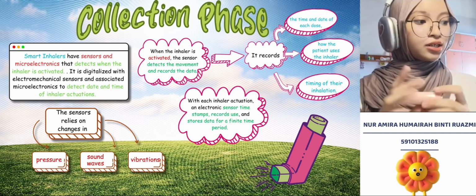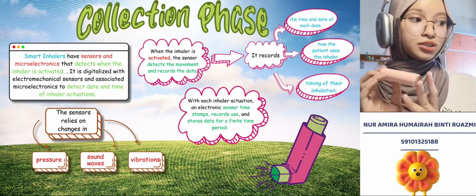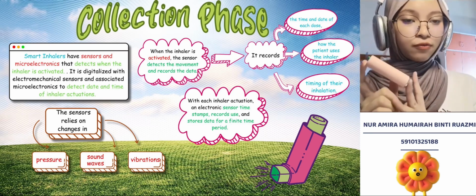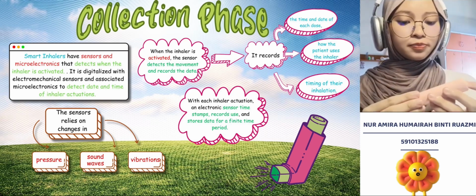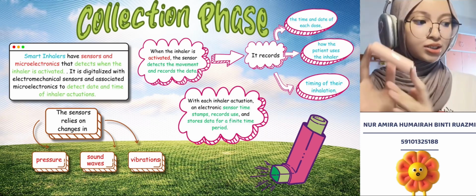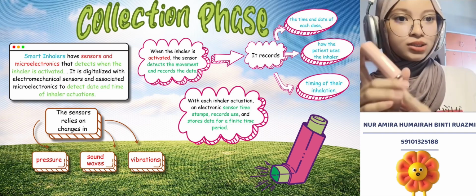With each inhaler actuation, electronic sensors timestamp, record use, and store data for a finite time period. The sensors rely on changes in pressure, sound waves, and vibrations.